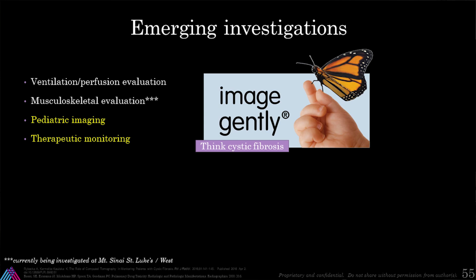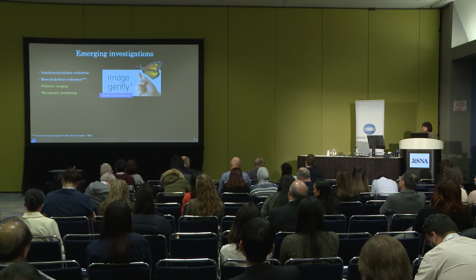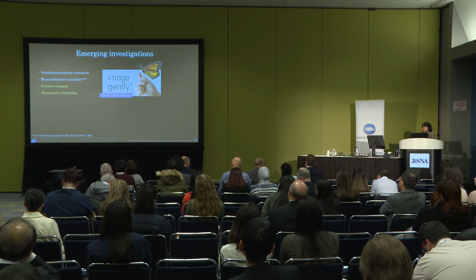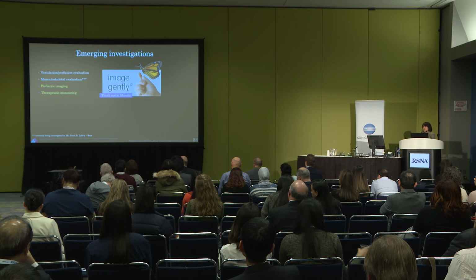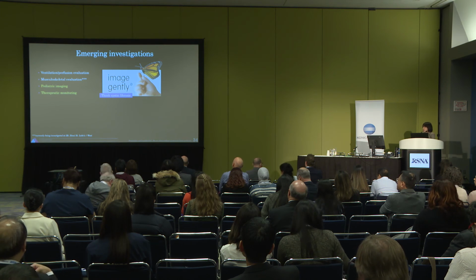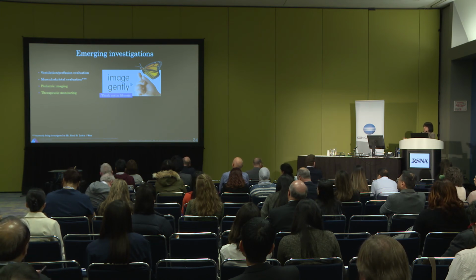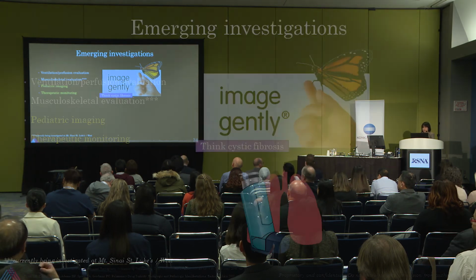And for dynamic digital radiography, think of diseases like cystic fibrosis that require young patients to be imaged routinely and repeatedly to measure the extent of their disease. I know they get a lot of repeat CTs throughout the course of their treatment. And the question is, what if we could instead use radiographs and evaluate their lung function and their anatomy at the same time in a low dose manner and track them that way? Again, not doing that research now, but that's an area to be interested in.